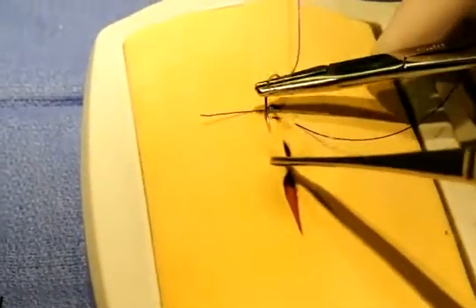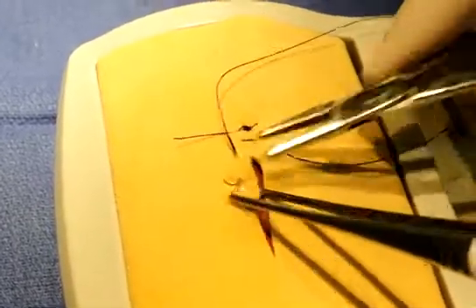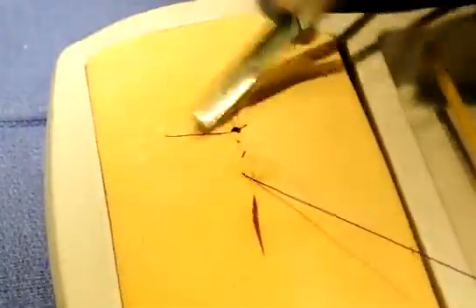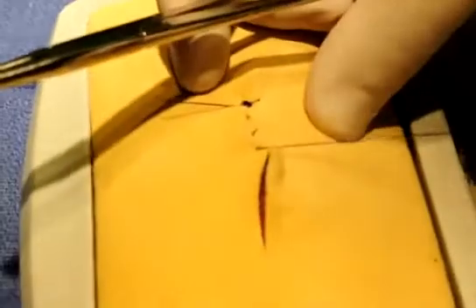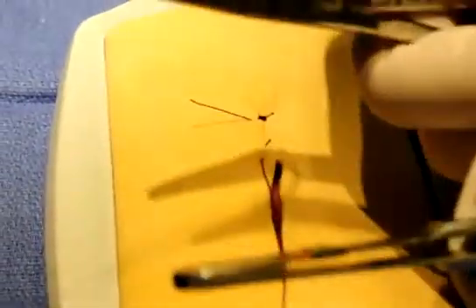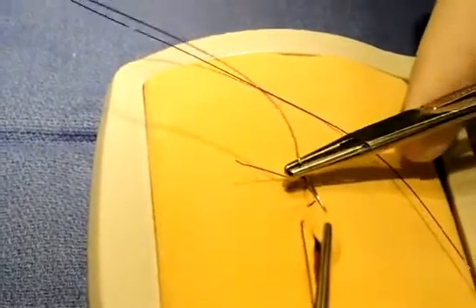Coming across again into the submucosa, but not penetrating into the mucosa. And you can see these edges being rolled inward. See that? Rolling it in like that. And I'm doing this with the forceps, but you can see that that's happening because these cross bites are getting very close together. The only way that can happen is when the edges are rolling in. I'll do one more. Okay. Alright.